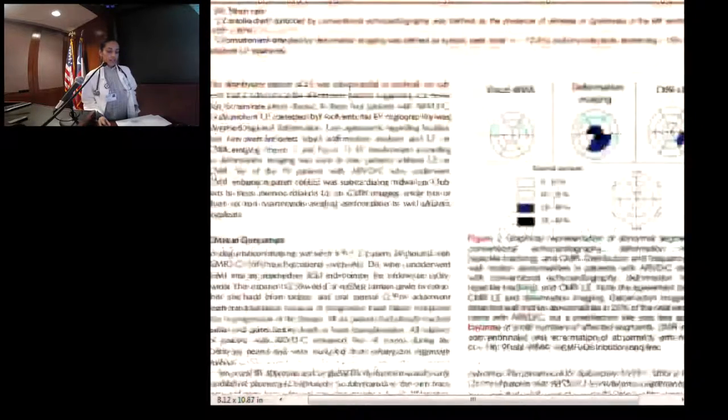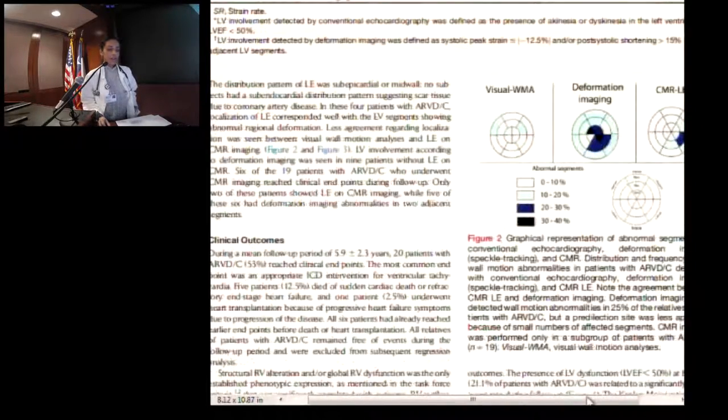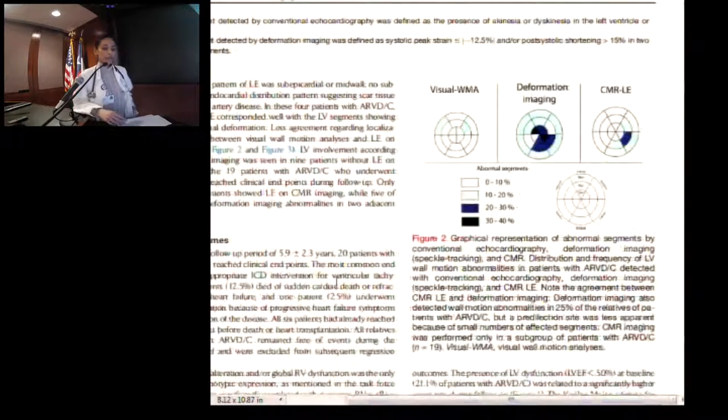And so then this is the representation of the segments that they were using as far as looking for LV wall motion abnormalities. How feasible is doing 4 segments of strain? You need some experience. Especially 4 segments, especially with echo. Unless the computer... I was thinking of what software they used to do the strain, because maybe that's the way that software is. Still, you're the one putting the region of interest.